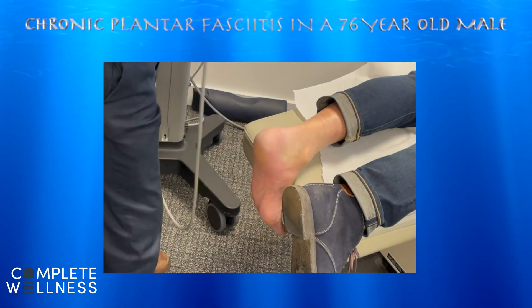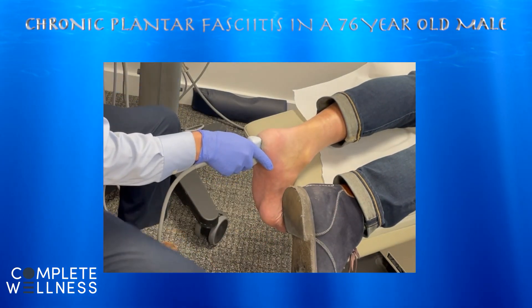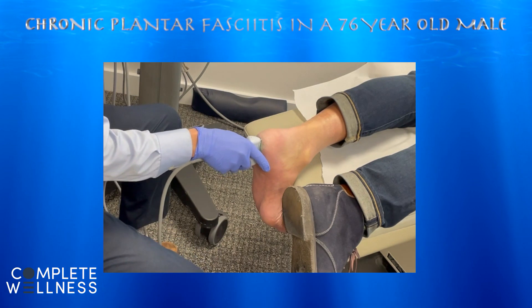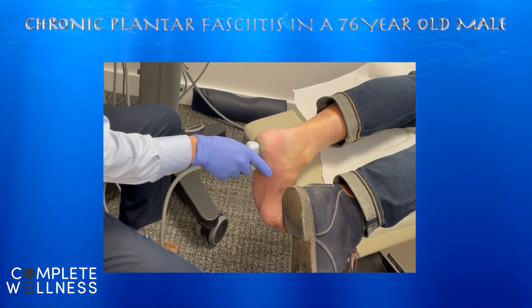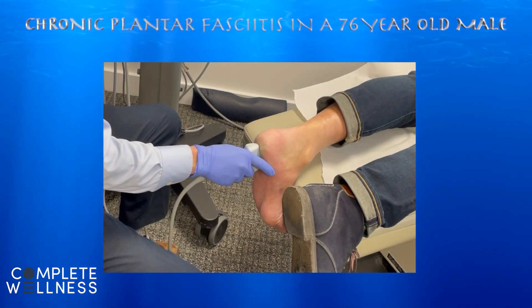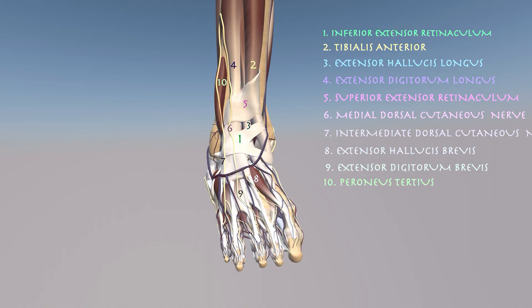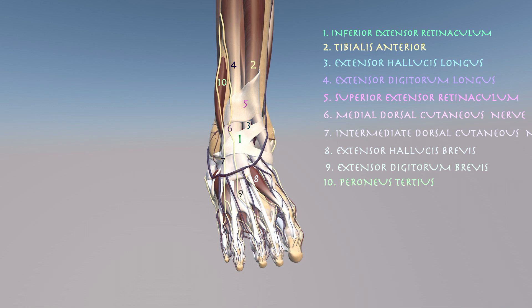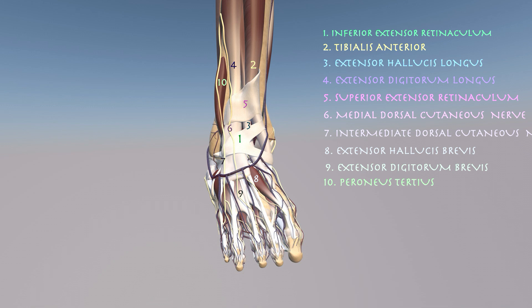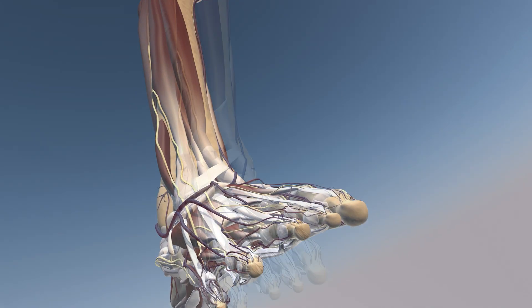Ultrasound of the bottom of the heel is challenging because the tissue is so thick — you really have to press hard to get a good view of the plantar fascia. We are going to go over foot anatomy, focusing essentially on the plantar aspect of the foot, although in these initial images we are seeing the dorsal aspect of the foot.